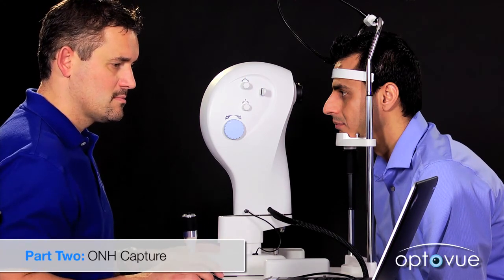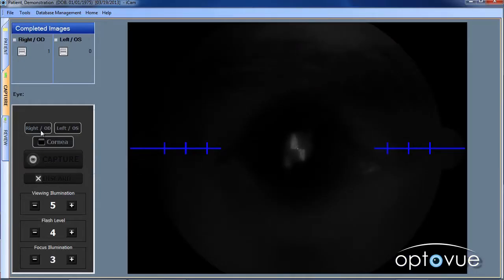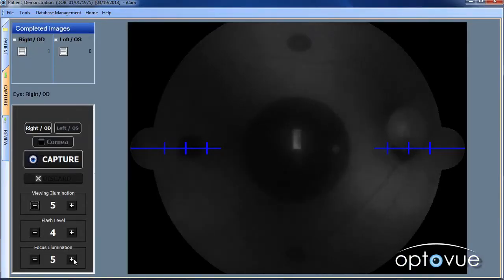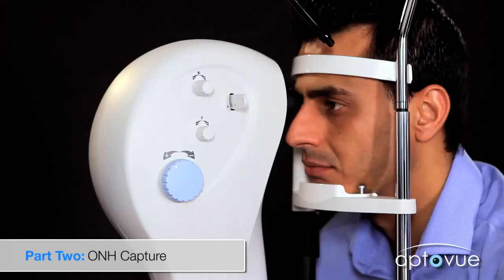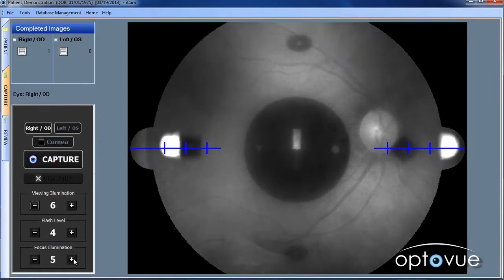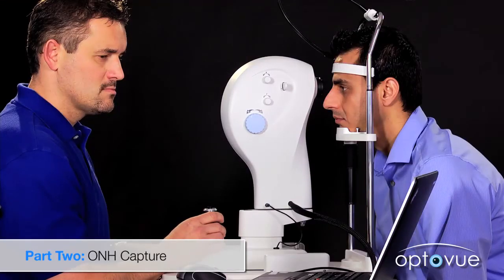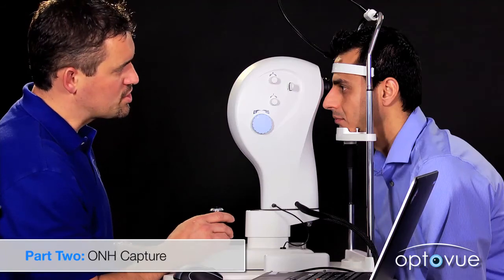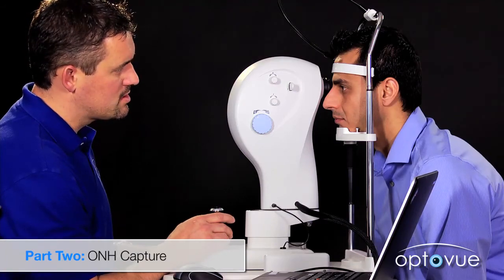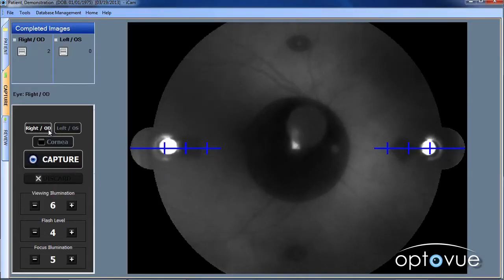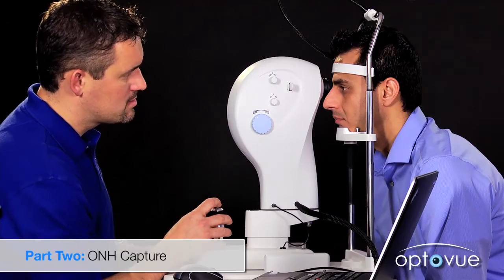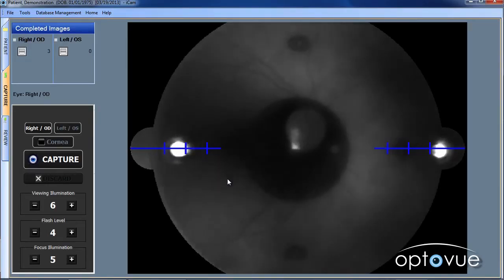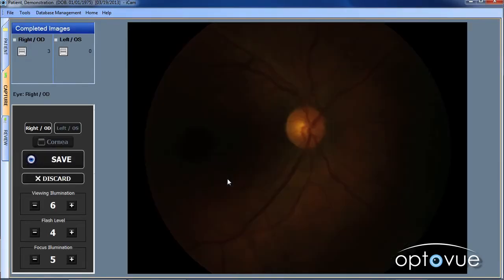Select the eye. Push forward, find the pupil, and focus. Continue forward until the WDI appear. Ensure the optic nerve is central, coaching the patient if necessary. Ensure the working distance indicators are aligned and sharp. Ask the patient to blink. Capture the image with the joystick. Evaluate and save.